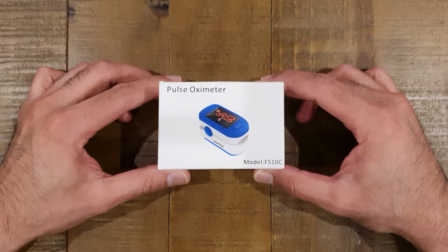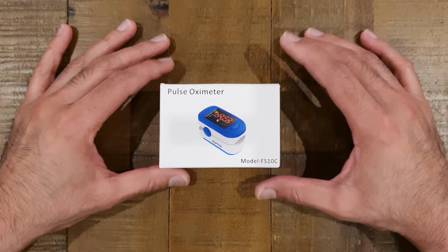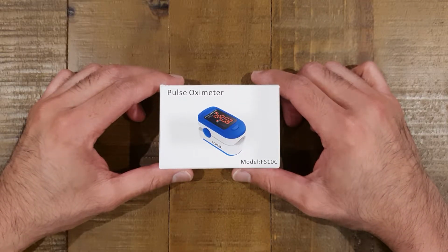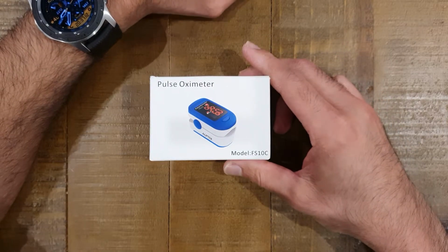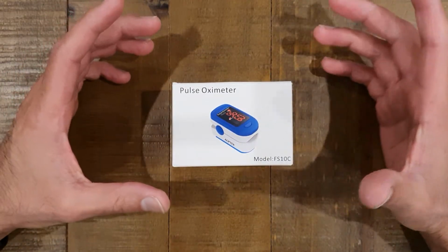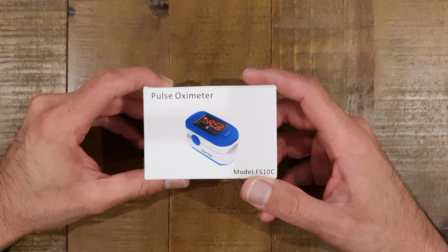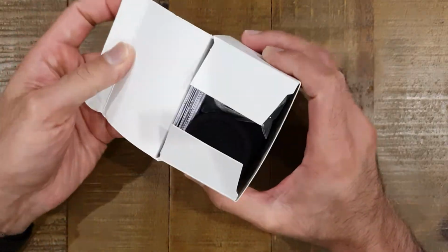but we do know what a good, healthy blood oxygen level should measure, and the standard measurement is that our blood oxygen level should be sitting somewhere between 95 and 100%. So what we're going to do is we'll pop this onto my little finger here, and we'll see what reading we get. And then also for the heart rate, we'll compare the heart rate that the watch records to what this pulse oximeter records, just to see the variation in the result sets. Again, I'm not a doctor, and I don't know what to expect. I don't know what's good, what's bad. But going by reviews, this is a product that for a fair price has got very good reviews. If it's going to give me a reading between 95 and 100, and I'm assuming I'm fairly healthy, then maybe it's working accurately. Let's go ahead and open it up.